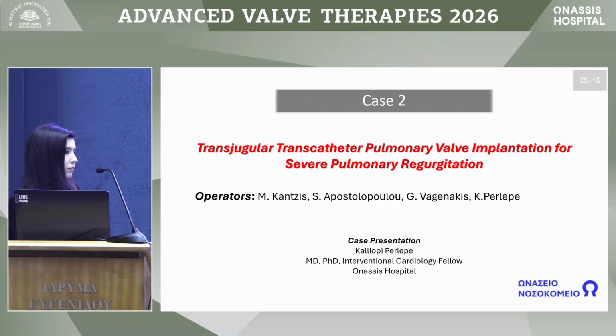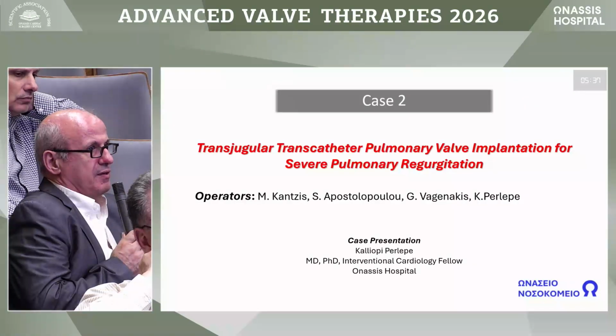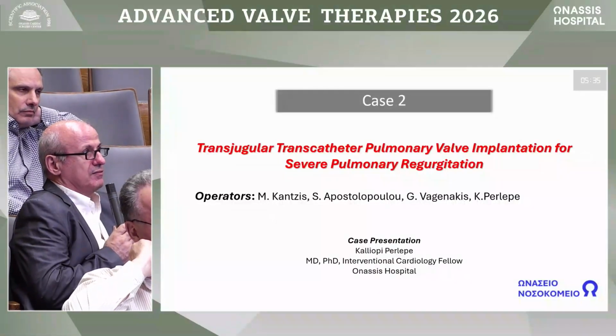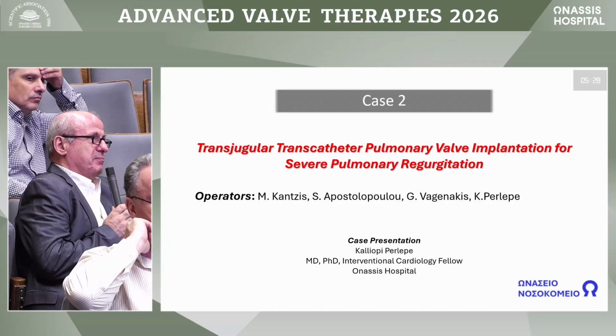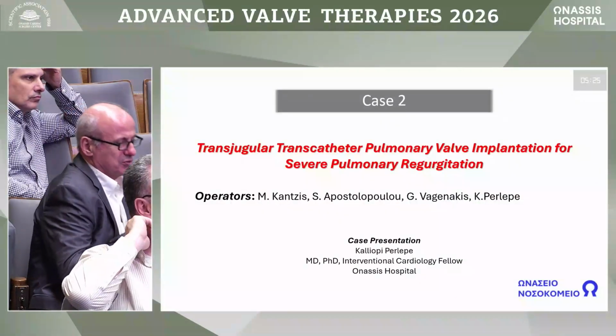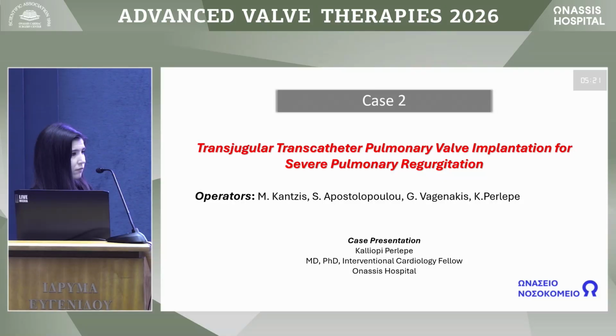In aortic, to use a two balloon technique? Certainly larger than the inner diameter of the valve. Yes, but using two balloons instead of one. No, never had to use that. Maybe it's very interesting. Till now, no, never. We don't do that, but maybe that's why we have you here.